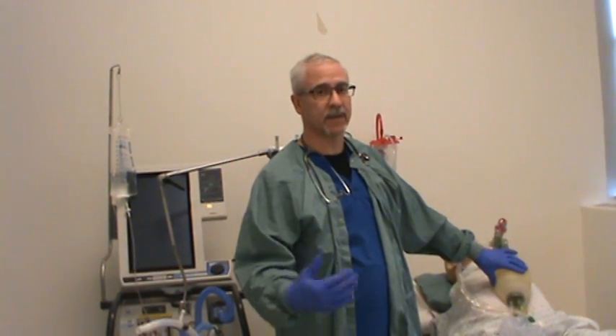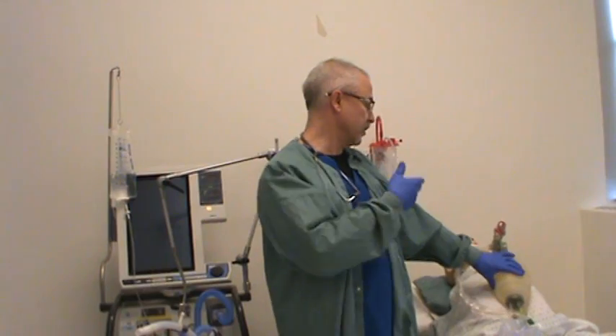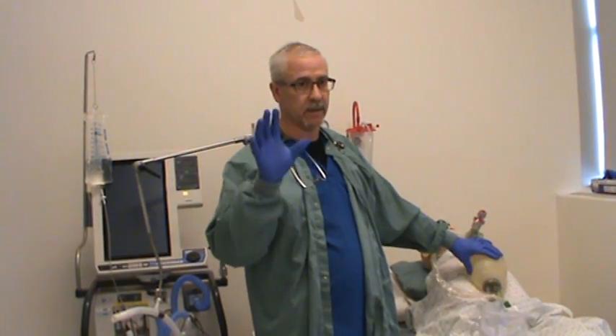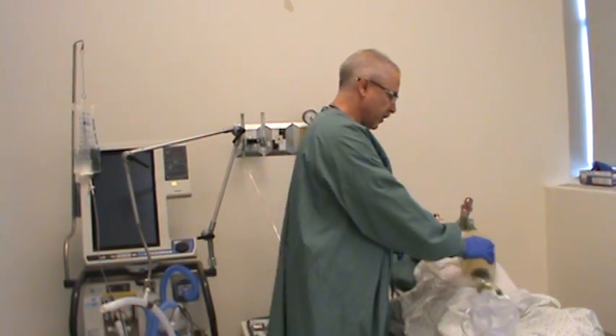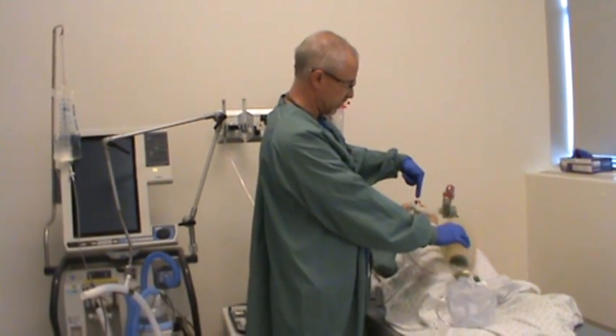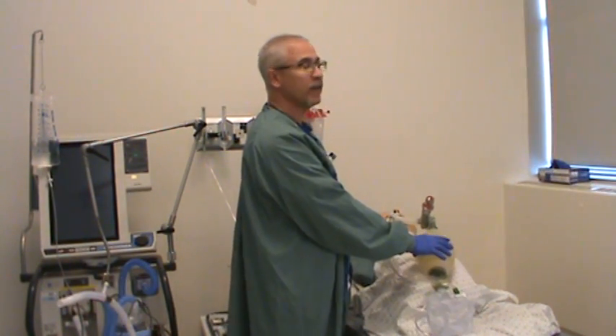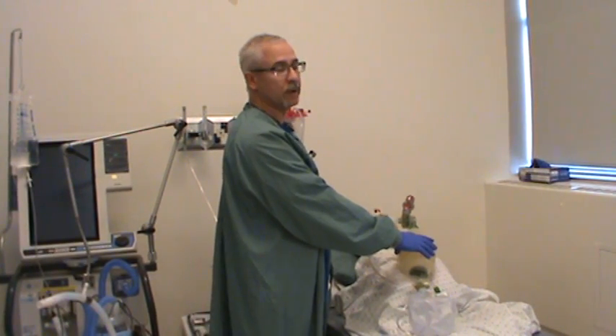To assess, listen to their chest with your stethoscope bilaterally. You can also observe the endotracheal tube to see if there are secretions coming out, and just look at your patient to see if they need suctioning. Before suctioning, make sure you have your personal protective equipment on: goggles, gloves, a gown if needed, and a mask — anything required for this patient's level of isolation. With the bagger we have the tapered flex tube that comes with the suction system, a bagger with a diverter, PEEP set to roughly five centimeters of water pressure, and ventilating at a rate of roughly 12 to 14 breaths per minute.